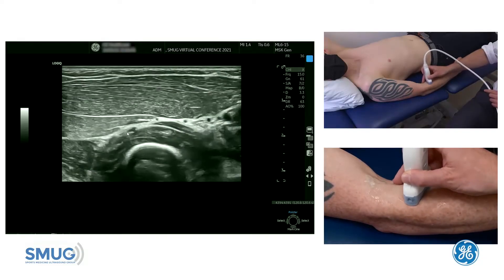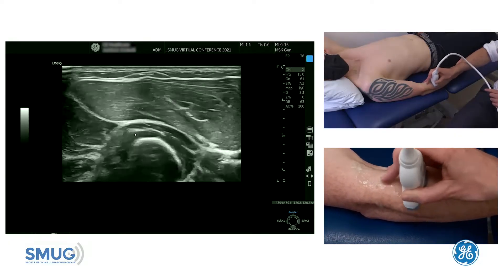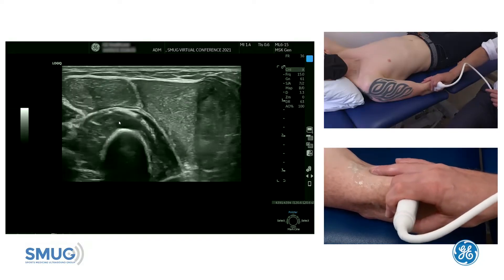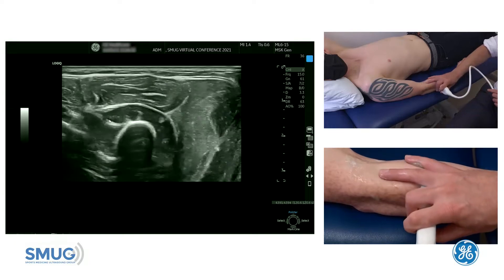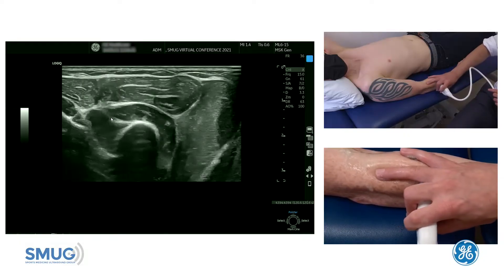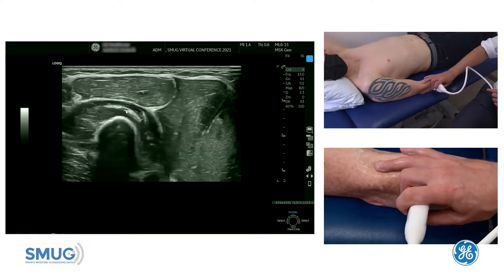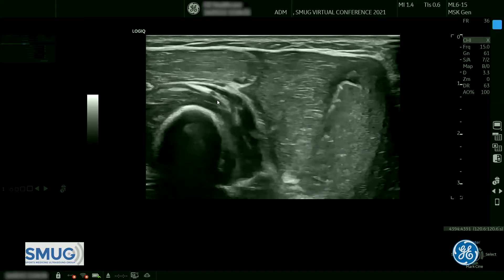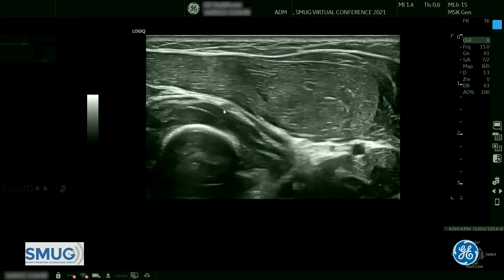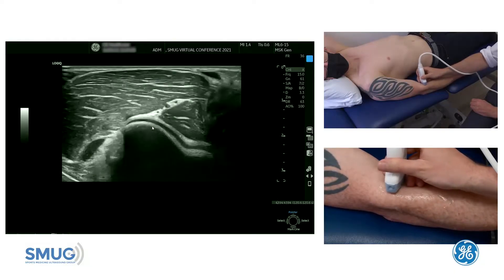You can actually see in this case it does get a little bit thicker just as it goes through the arcade of Frohse. As we go more distal, it's really important to follow it all the way down — we can see it between the two heads of supinator, the deep and the superficial heads. We must follow it all the way down until it comes out the other side, and you can see there is a site of entrapment. Following it back up proximally, look for any atrophy in the deep and superficial heads, concentrating around that arcade of Frohse.